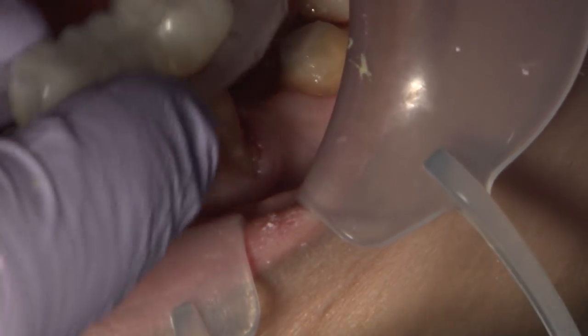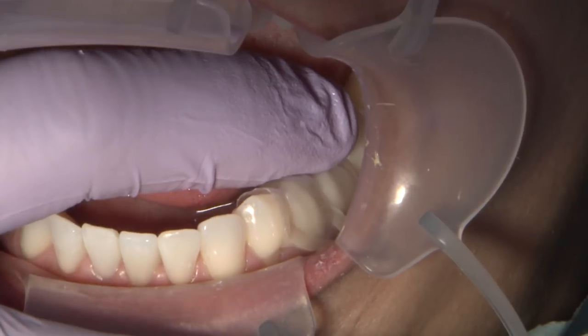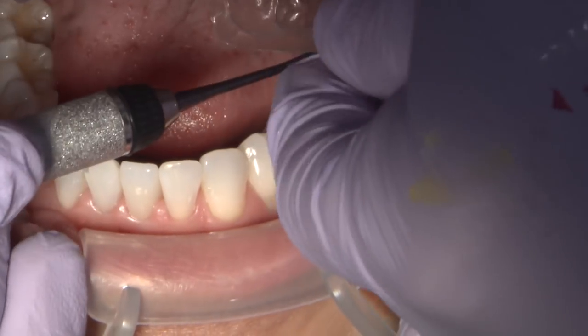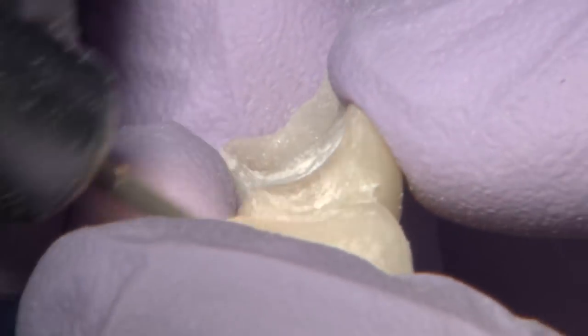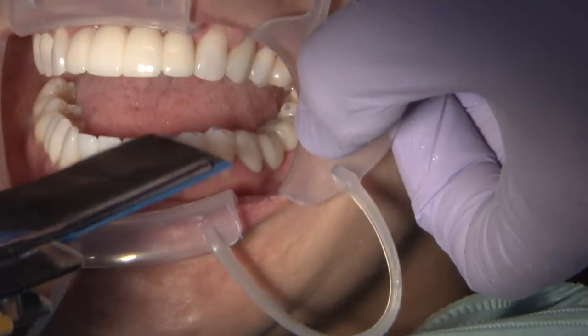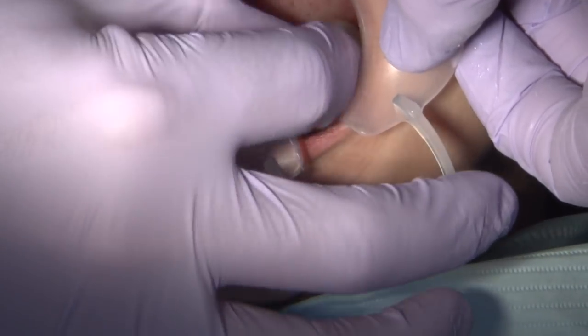I think one of the more difficult placement situations for any temporary is a posterior 3-unit bridge. We are always limited with occlusal space and biting forces are more of a factor. The Fast Stent placement guide ensures that the temporary is suspended in perfect occlusion while the reline cures. A quick pop is all it takes to remove the stent, and the bridge BioTemp can be adjusted by first removing the excess flash acrylic, modifying the pontic to train the tissue for the final restoration, opening the embrasures, and then fine-tuning the shape of the individual units before trying it back in the mouth. I'll check the bite — no occlusal adjustment was necessary, and I attribute this to the accuracy of the use of a guided Fast Stent.